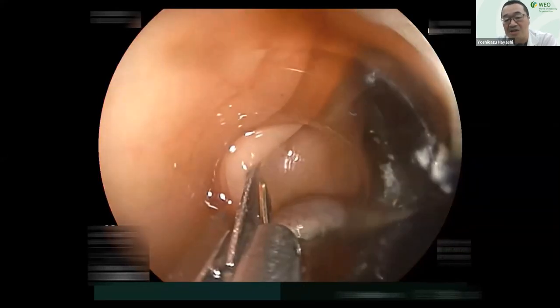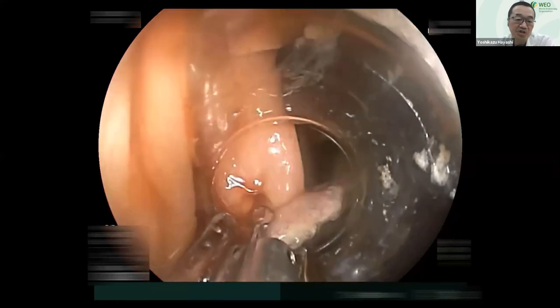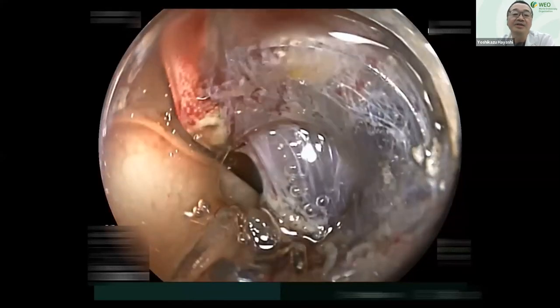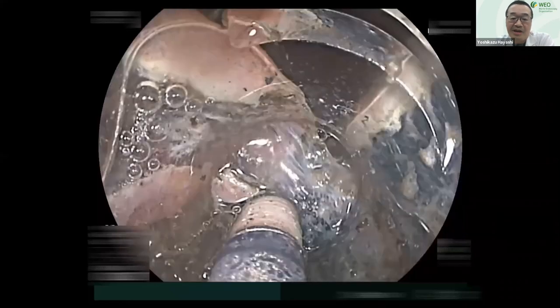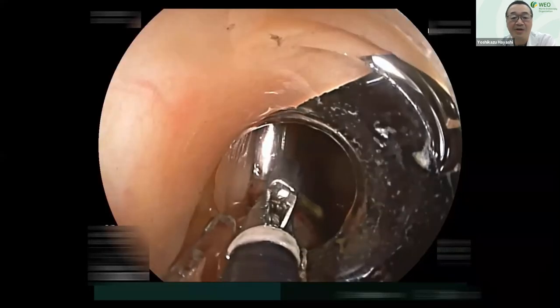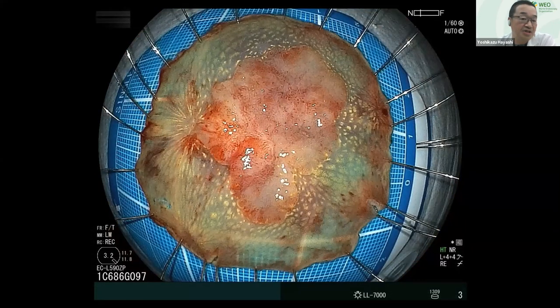After making the pocket, we put in a circumferential incision. Then we grasp the distal edge of the partially dissected specimen, pull back a few centimeters, and connect it to the opposite wall mucosa. After providing traction using a single clip, we can have a good view and stretch the remaining submucosa like this. Finally, we remove the clip using forceps. This region was a submucosal invasive cancer, although we achieved all the resections.